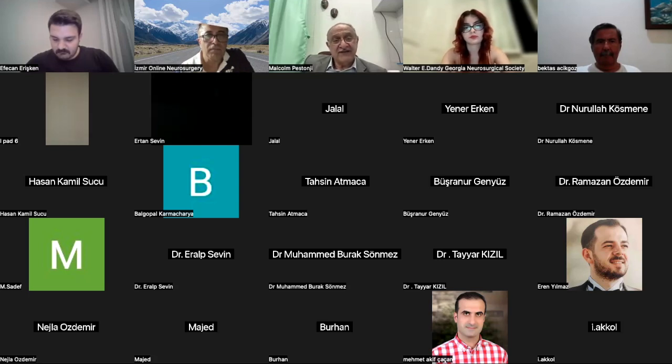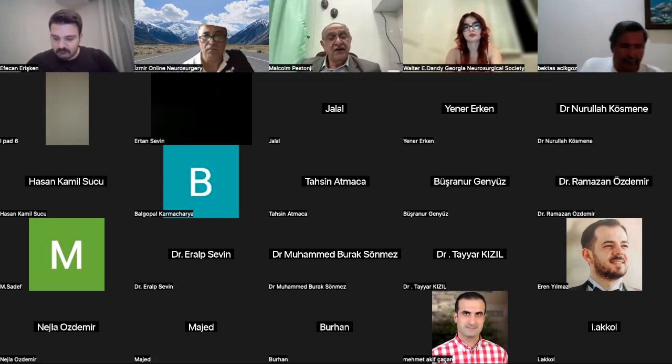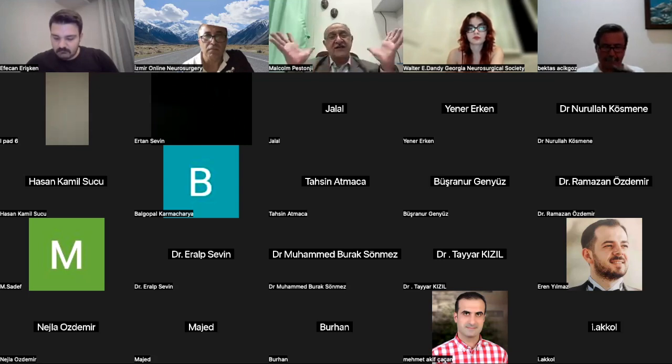While in plasma, we have a plasma cap. A ceramic cap is set on a tungsten wire so that when it generates heat and when you fire the plasma, if you've seen my videos carefully, you'll see a blue circle developing around the tip of the probe. And it is that blue circle, that energy field, which is the plasma energy field. So the plasma energy does what? It causes a dissociation of the ion of H and OH. And it causes the cell to rapidly enlarge and lyse.